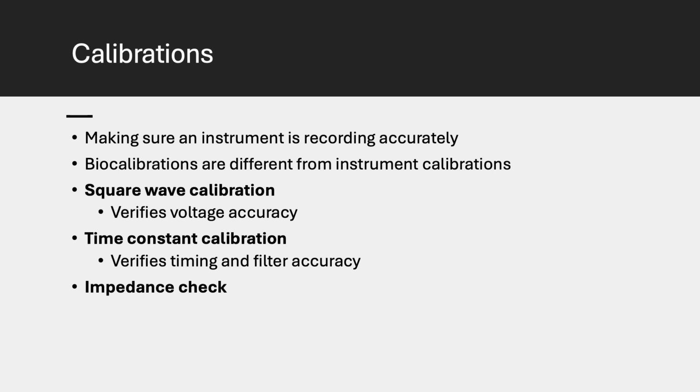Again, we want to aim for a target of less than or equal to 5 kiloohms, with the electrodes being relatively even. Although all electrodes need a good impedance value, the common ground and reference electrode impedance have to be low and secure because they are tied to each of the other signals.